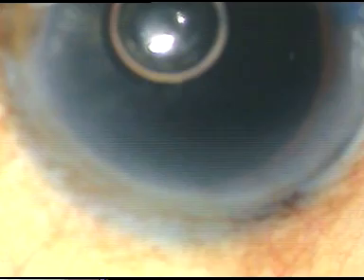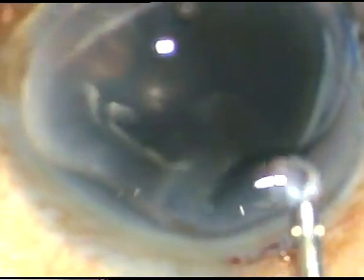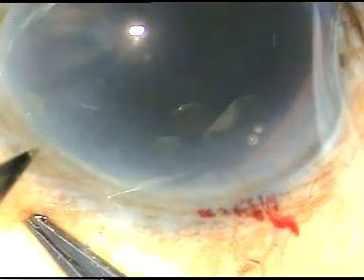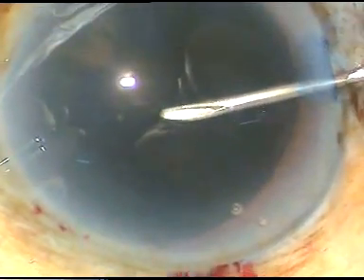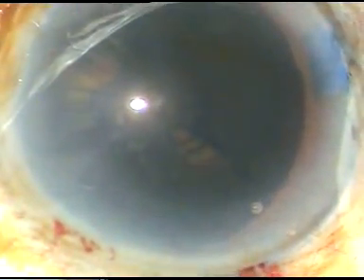Now, in such cataracts I always try to do a large rhexis. This is HPMC — hydroxypropylmethylcellulose — being used as the viscoelastic substance. The corneal epithelium has been coated with the same viscoelastic substance, HPMC. Now another side port is made at around 2.5 o'clock hours away from the main incision on the left side for introduction of the chopper. Now this is rhexis — a 26 gauge bent needle incises the anterior capsule and a capsular tag is raised. Now I take a Utrata forceps.